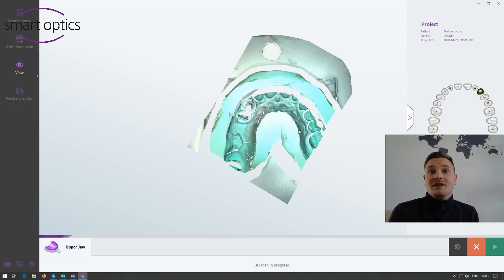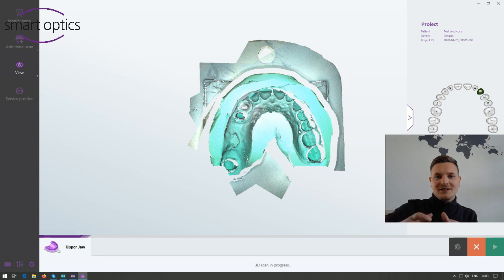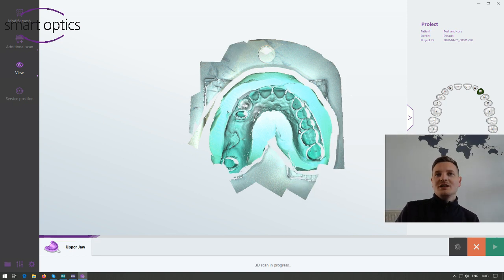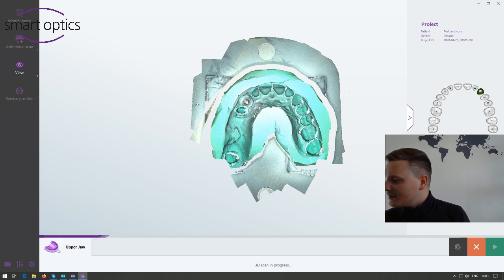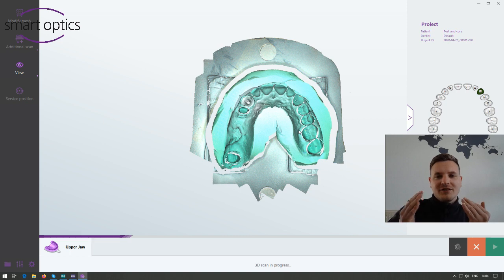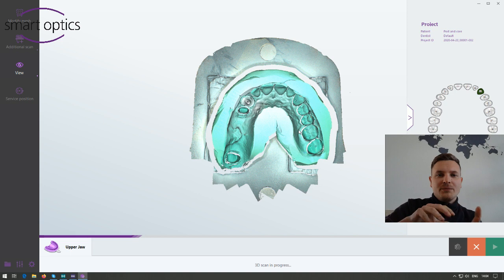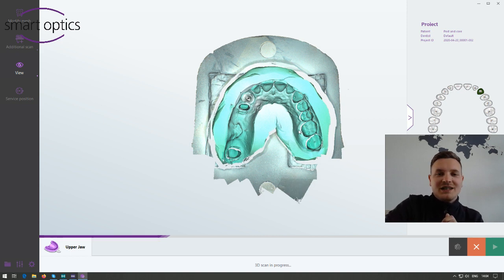Very important when you scan impressions: you need to cut the impression. If you have labial shields on the impression, it's necessary to cut them away because they disturb the view of the scanner. Please keep in mind — always cut your impressions before scanning and then you will get a good result.